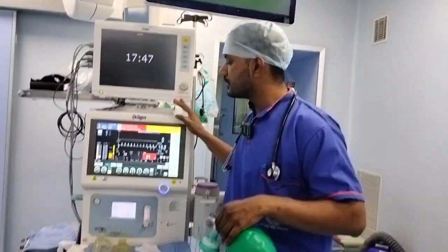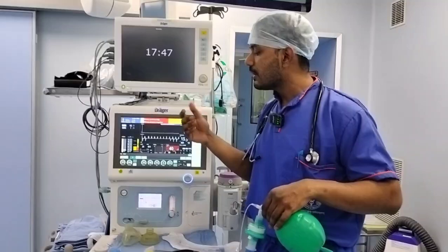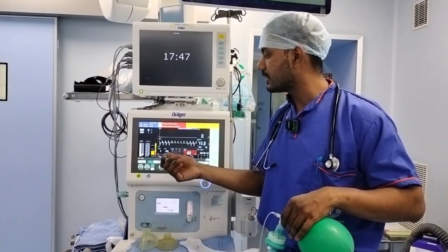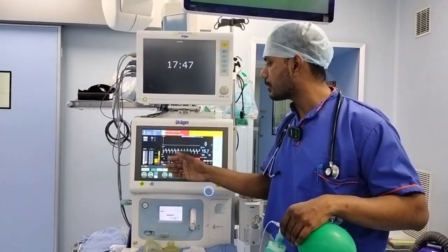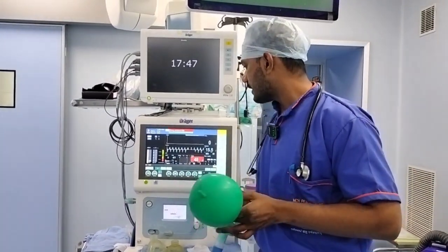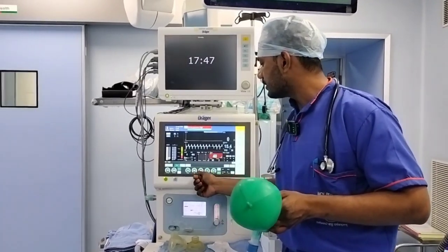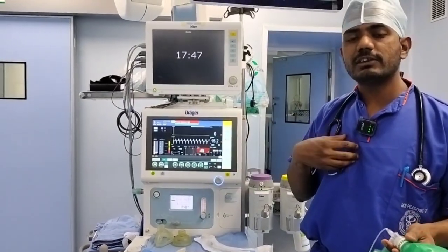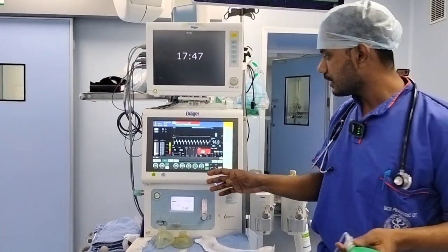This anesthesia machine has so many safety features, so that when the patient gets disconnected or is not getting ventilated or there is some problem, it will give some alarm so that you can take action to correct it. The next thing is respiratory rate, which is the number of breaths we usually take whether we are awake or under anesthesia.